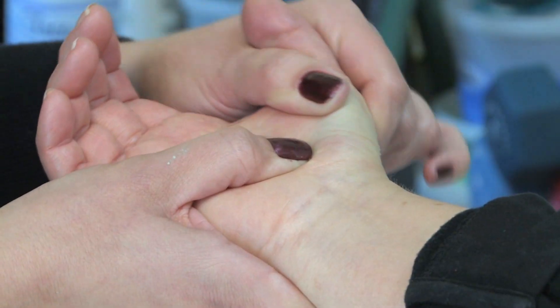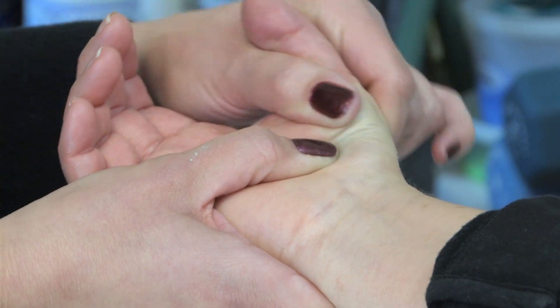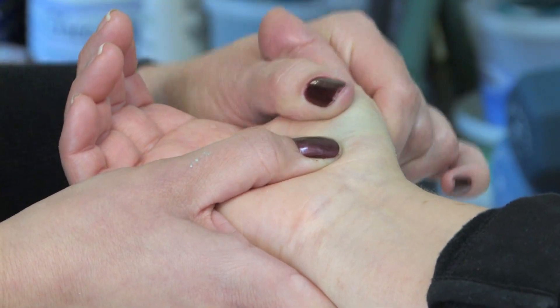Range of motion is very important for getting function back to any joint. So if someone has limited range of motion, they're going to have limited function with that body part. So getting the use of their hand back, their wrist back, their fingers back is very important. And I started using Dynasplint to help as an adjunct to maintain range of motion, to get difficult-to-get range of motion in a very stiff joint or after a complicated injury or surgery.